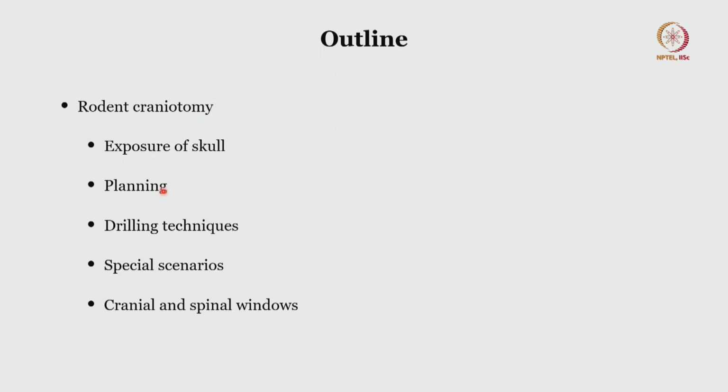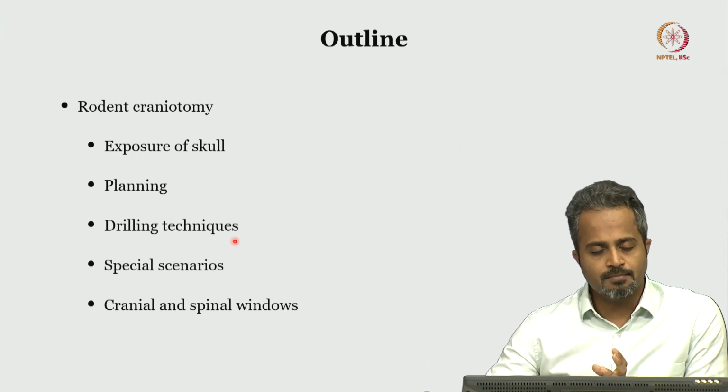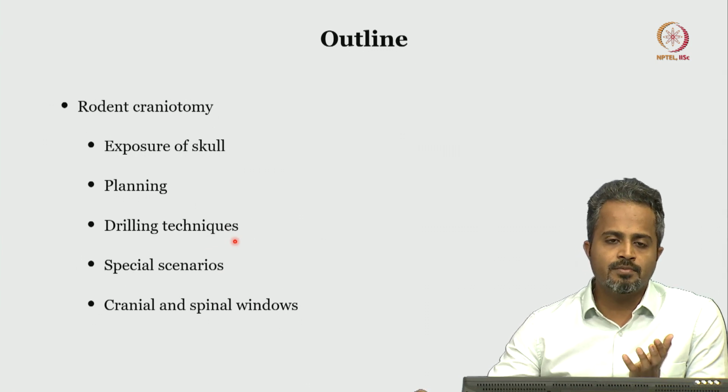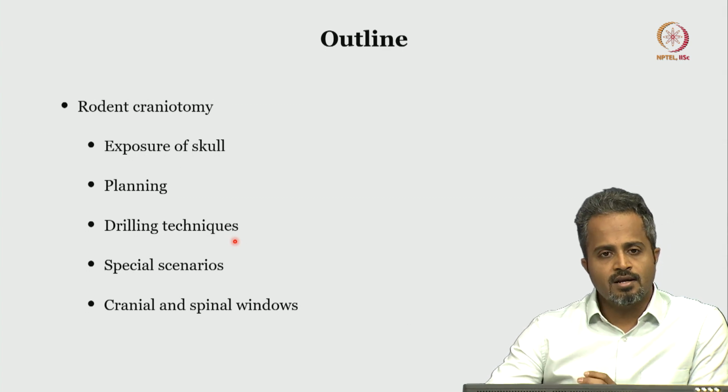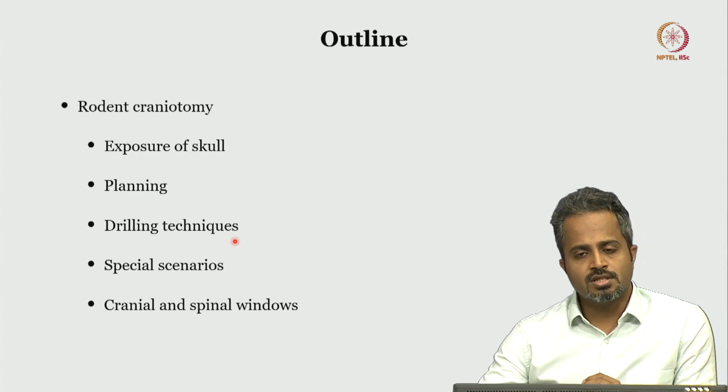So that's the outline. I'll briefly touch upon the exposure of the skull so that there is some continuity from the previous session. Then a little bit about the planning, mostly on the drilling techniques, because this forms the workhorse and this is a very crucial step in rodent neurosurgery. This step is common for craniotomy as well as stereotactic techniques. So one has to master this usage of the drill.